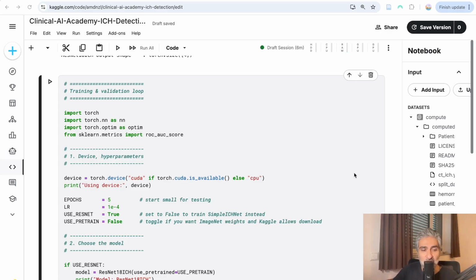We did a lot of pre-processing and a lot of data handling. There are usually teams doing the data curation and the pre-processing, and then using built-in libraries to prepare the data for the training. With medical images, you have class imbalances, so you have to deal with them. For the training itself, the architecture is there.